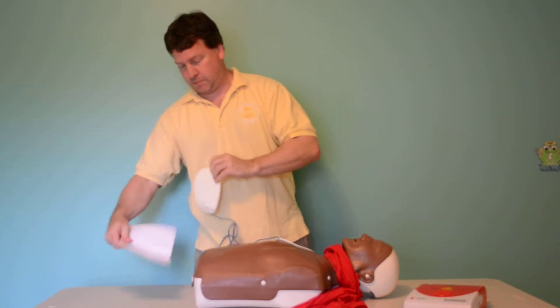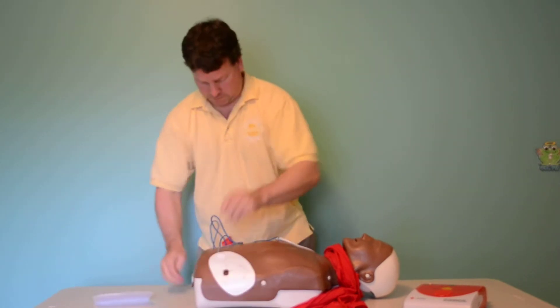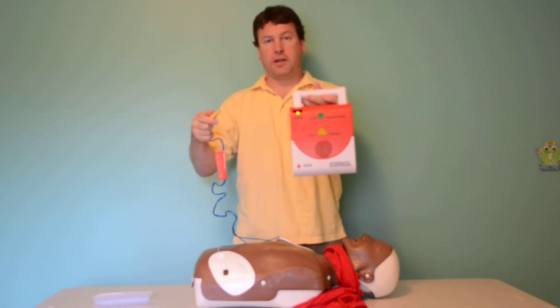Plug in the connector. Check the connector and pads.